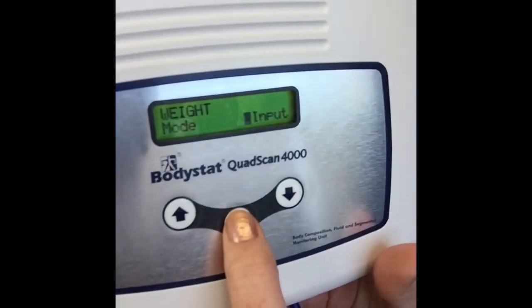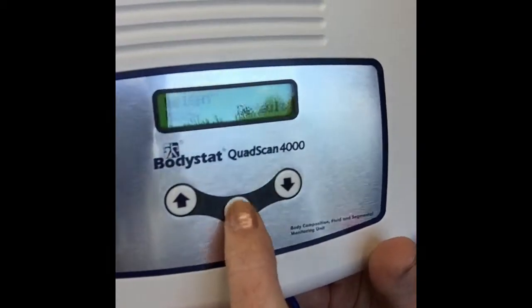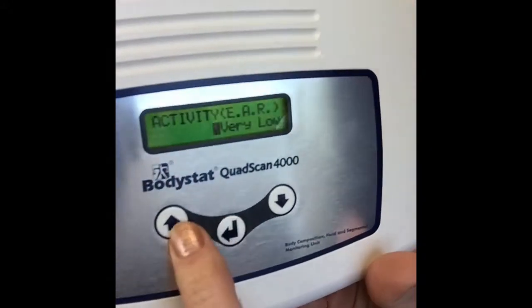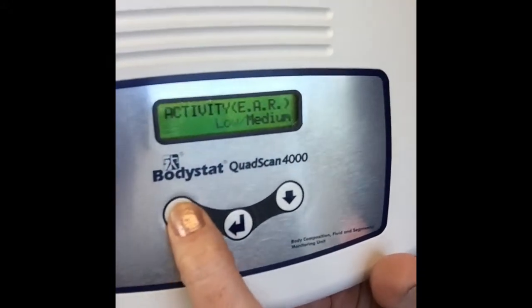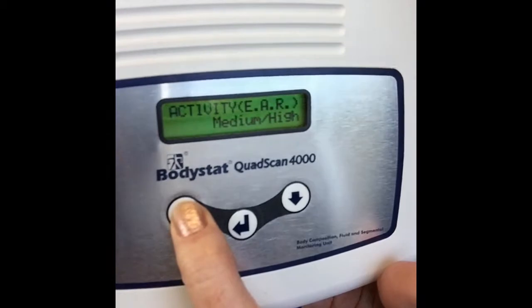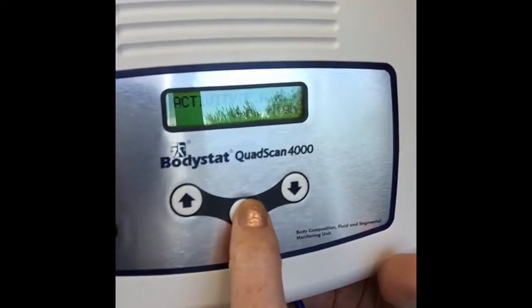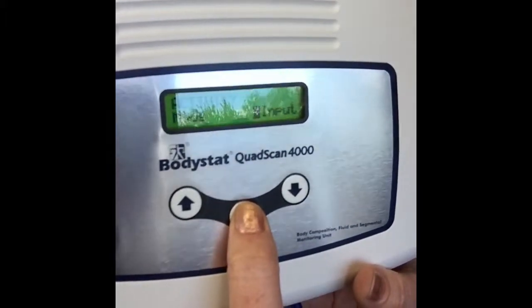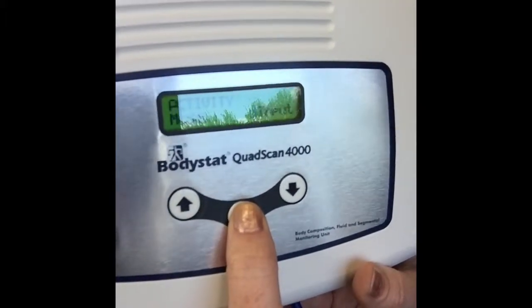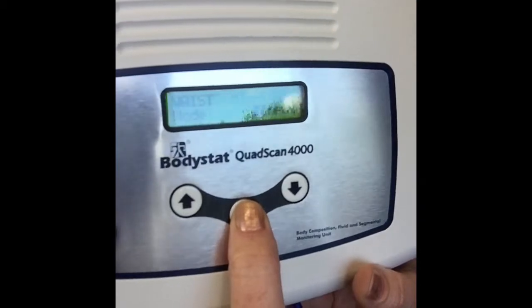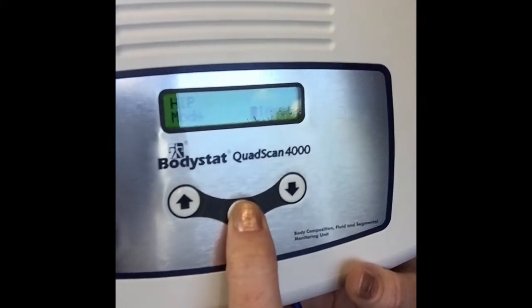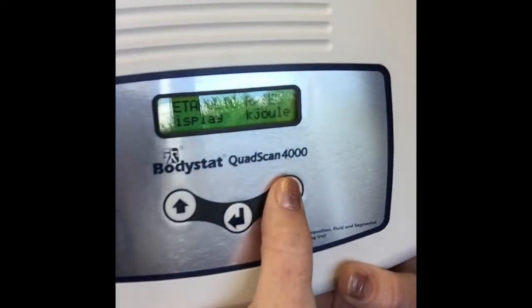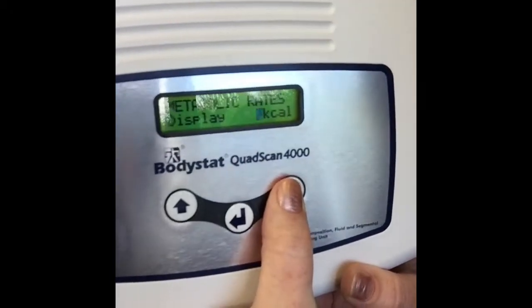Again we've got the input, default, and omit options — we'll keep that as input. You can also change the activity level; if you're dealing with athletes you can click the very high option, which saves you from scrolling through each time. Likewise you can configure all the other parameters through the menu, including waist, hip, and metabolic rates. You have the option of changing metabolic rates to kilojoules or kilocalories.